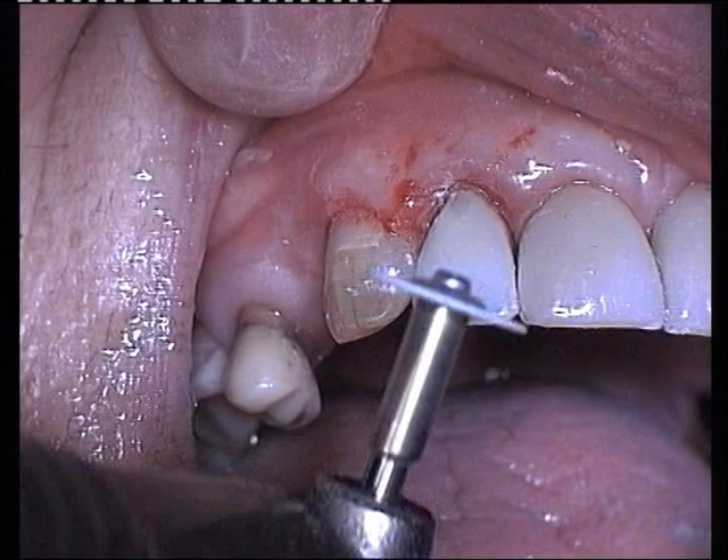The margins of the crown are now checked for overhangs. This is the finished restoration.